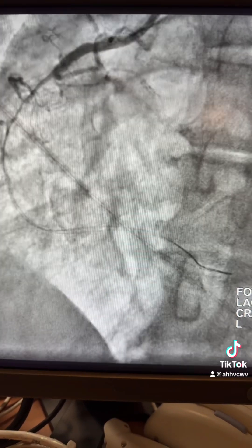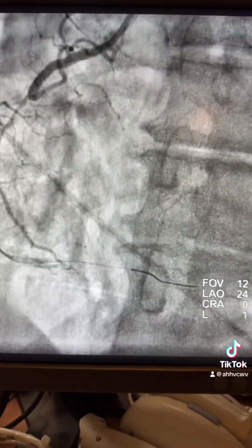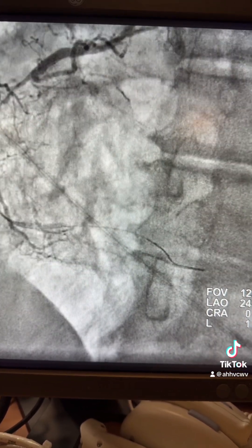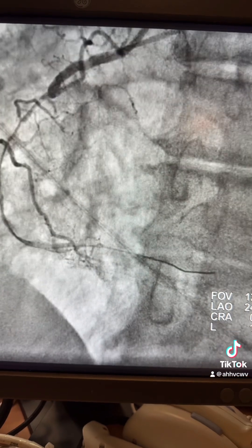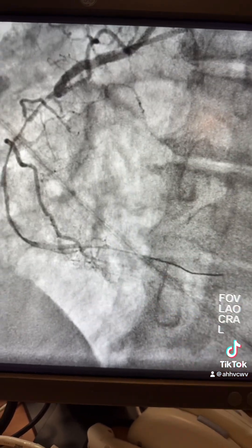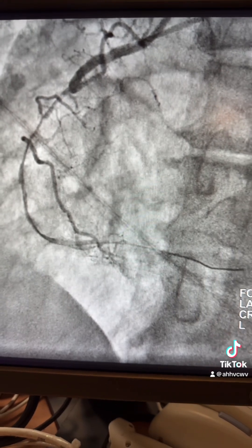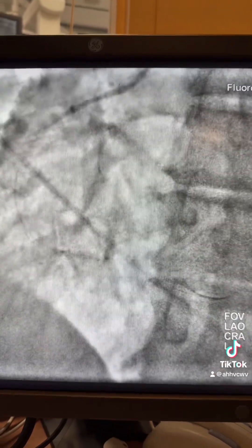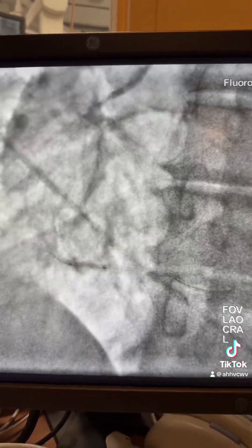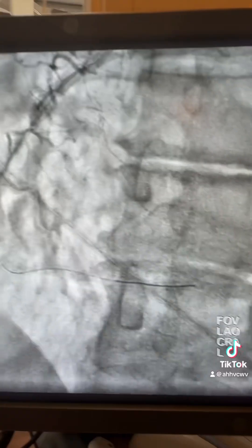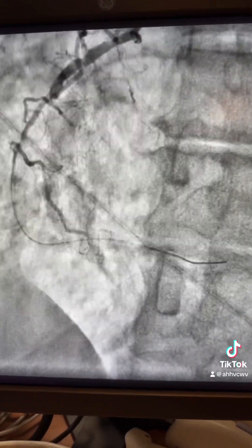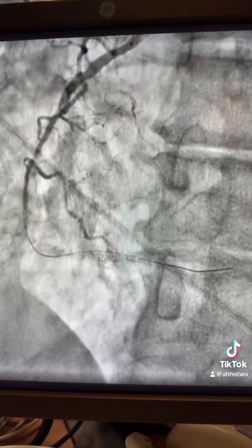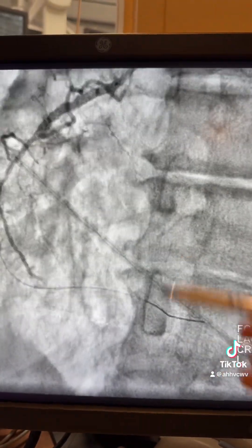Here is the angiogram — there is some reassurance that the wire is in the true lumen up to this distal segment. We start ballooning with a 2.0 balloon; here I have to use the guideliner and the 2.0 balloon, ballooning from distal to mid. This segment on the angiogram still cannot confirm the true lumen, so the wire has to be redirected.